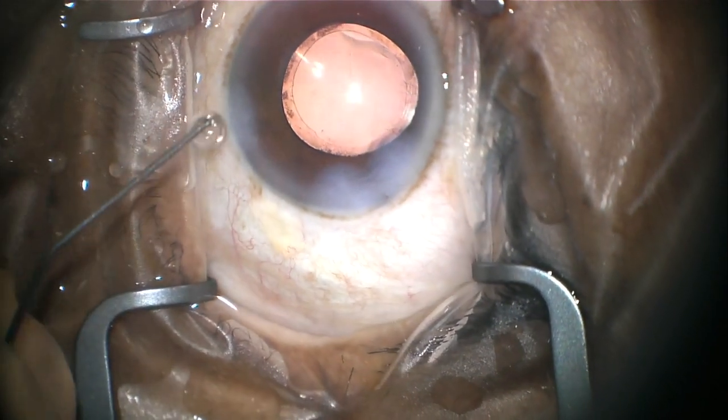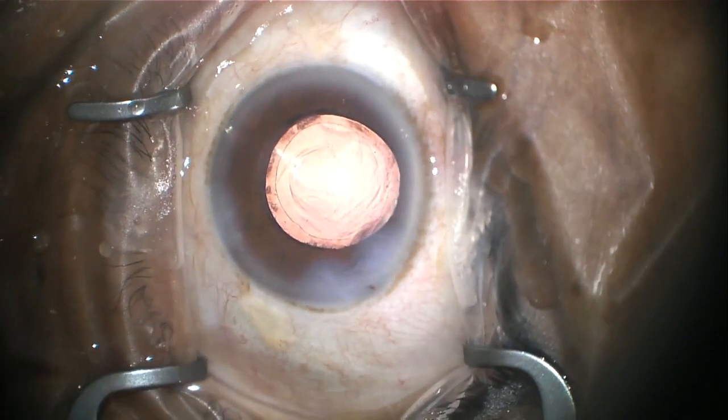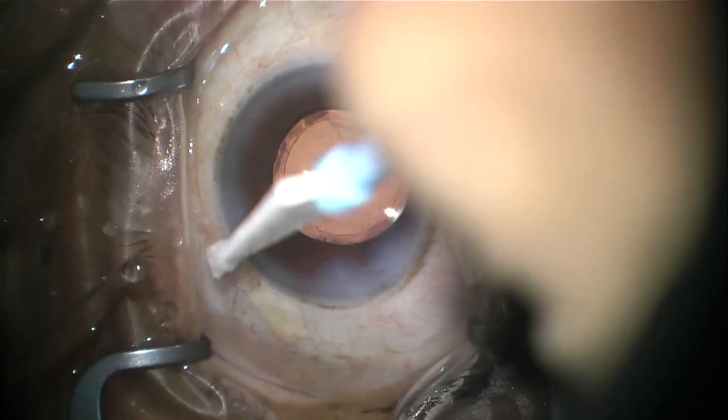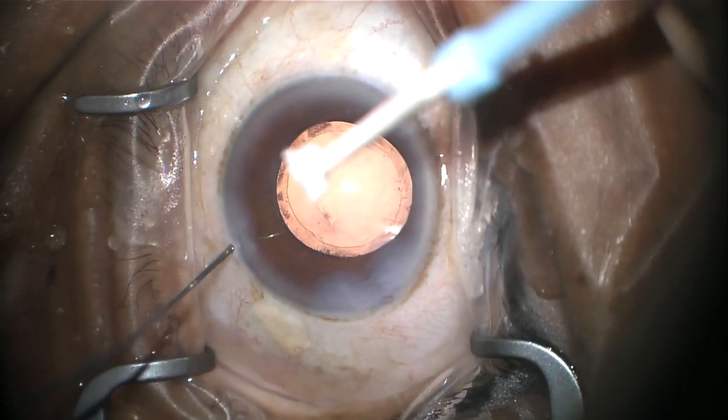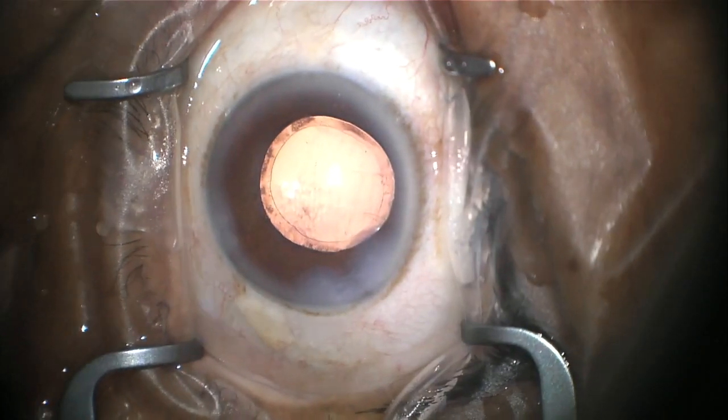After we know the wounds have sealed, we inject some antibiotic inside the eye to help prevent infection. After the antibiotic has been injected, the wounds are checked for any leakage and the eye is checked for pressure. Once we know the pressure is good and the wounds aren't leaking, the surgery is over.